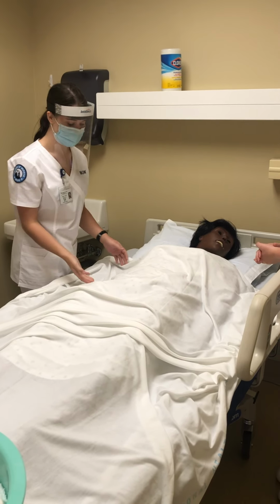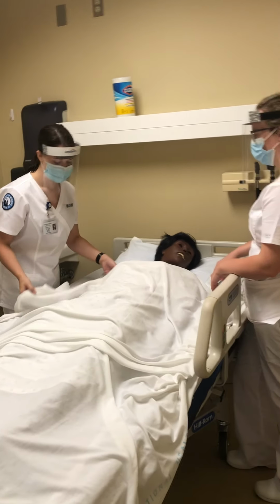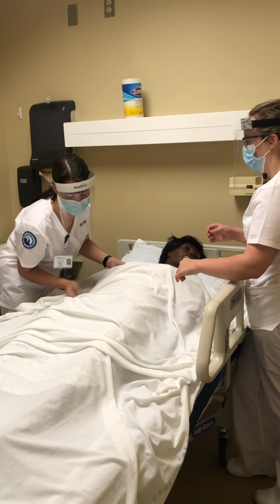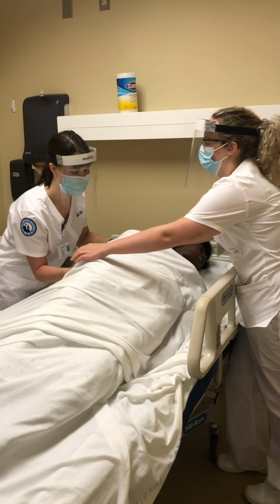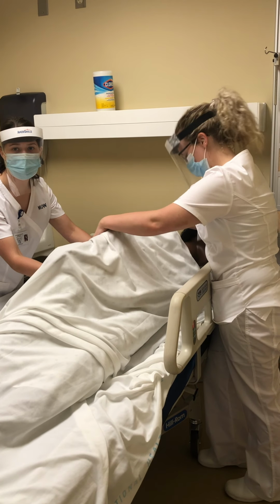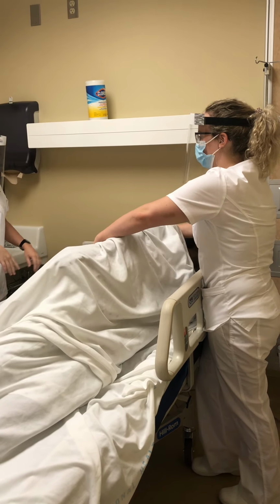Then we're going to roll her over onto her side, keeping her as covered as possible. Like I said, you want to keep her as covered as possible with that top sheet to ensure patient privacy.